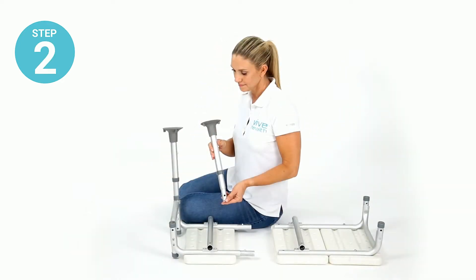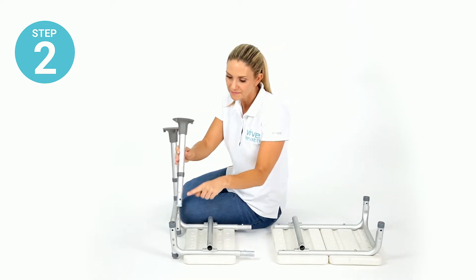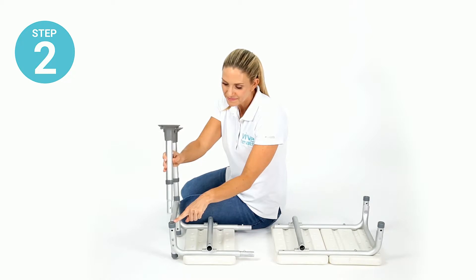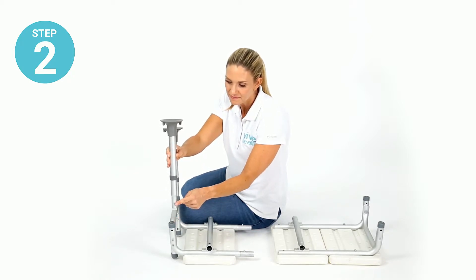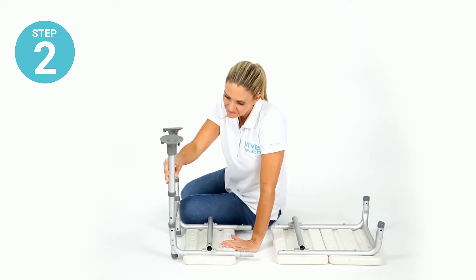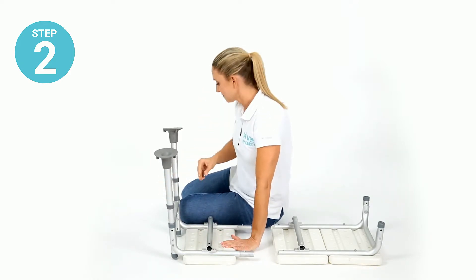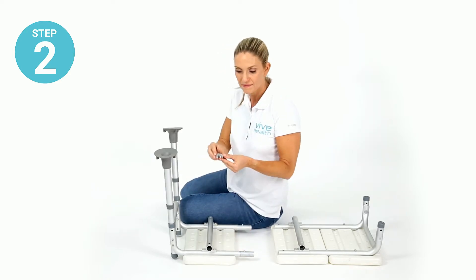Step two: fit each bench leg with pre-installed suction cup foot into the leg sockets on the small seat section. Make sure each leg is fitted in place to align the holes in the leg with the holes in the socket. Secure the pieces in place with a collared locking pin.